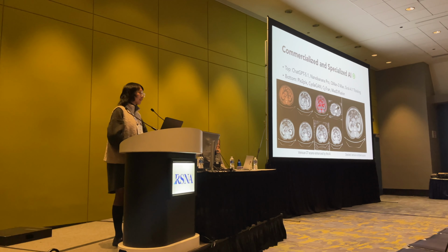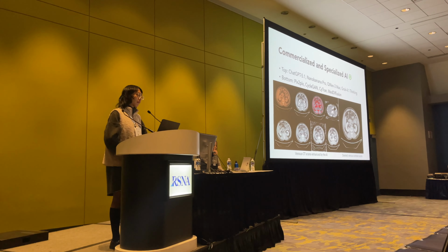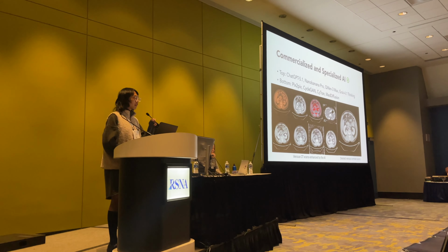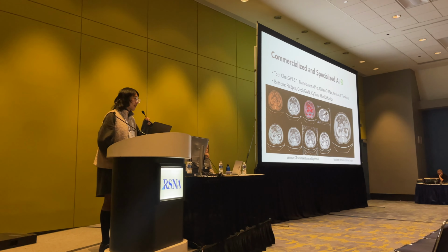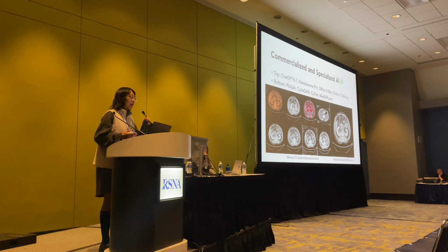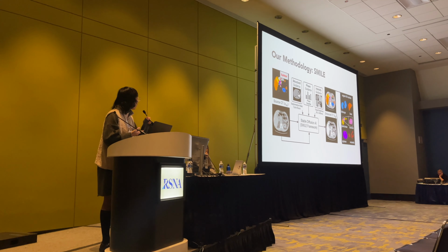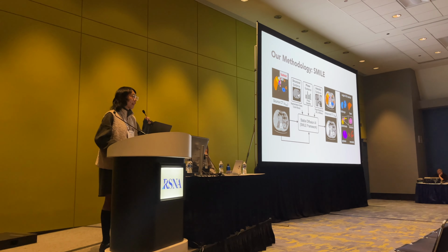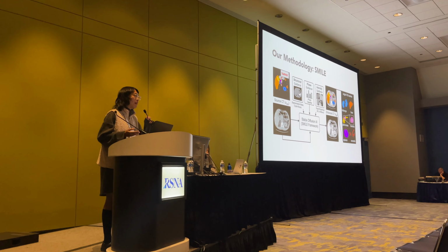This is very interesting work. I'm wondering if this model can be adapted to identify areas of high vascularity within the organ, within the tumor, because that might be of interest when it comes to response prediction. Thank you for this question, and my answer is yes. Actually, this is a plug-and-play part. You just need to change some of the structural segmenter or disease identifier here, and our system can enhance the patterns to identify the lesions you mentioned.